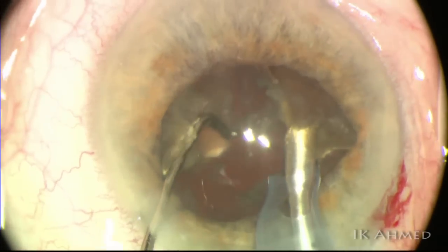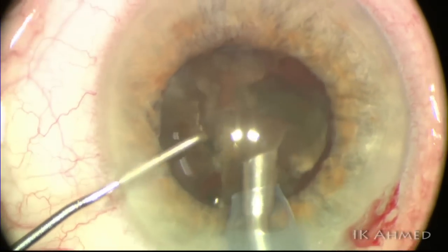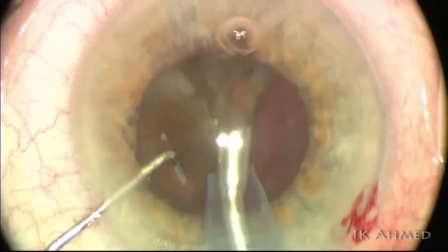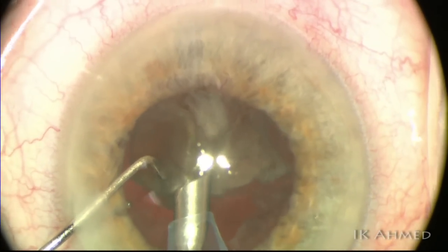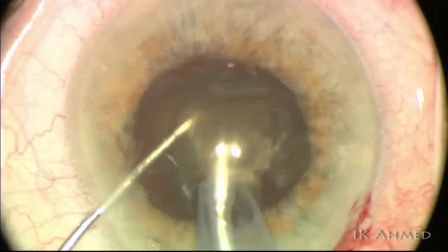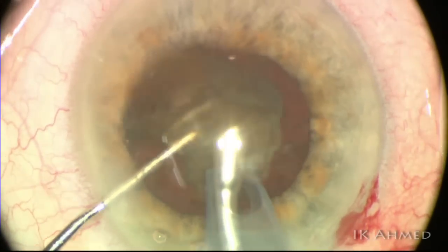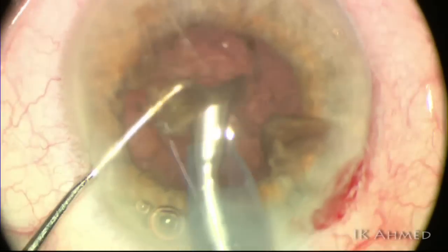Here we have the remaining two-thirds portion of the hemi-nucleus being chopped. Being careful to carousel the pieces along prevents chatter. The energy here is hyperpulsed — we know the benefits of hyperpulsing, and torsional phaco may be used as well in certain tip designs. With the last segment, we must be careful to prevent going through the nucleus or causing surge, which may engage the capsule. Often we inject a little viscoelastic underneath the nuclear particle here for safety.